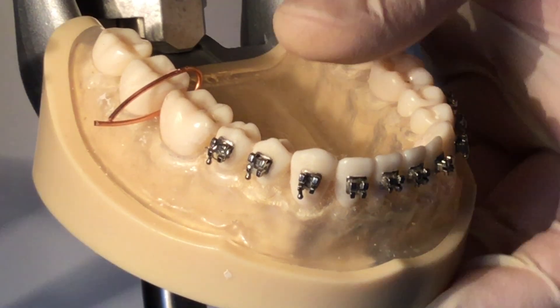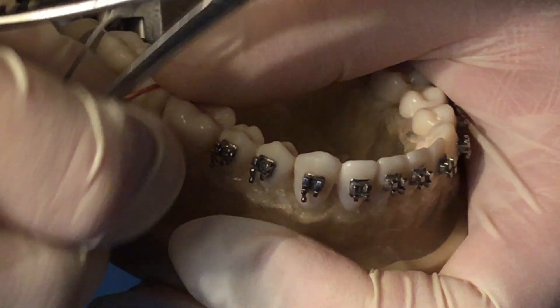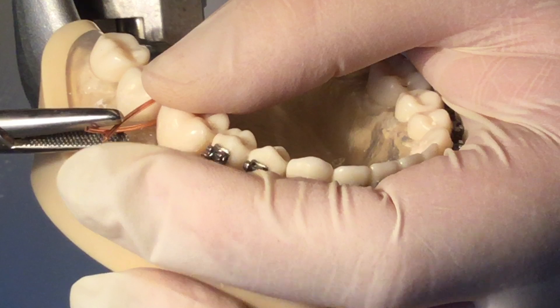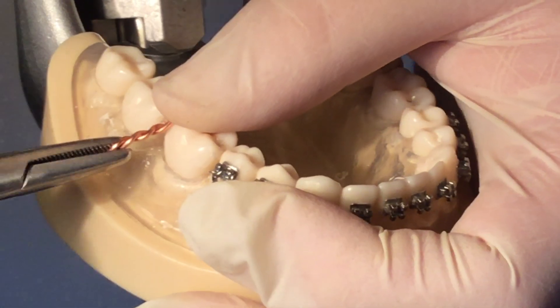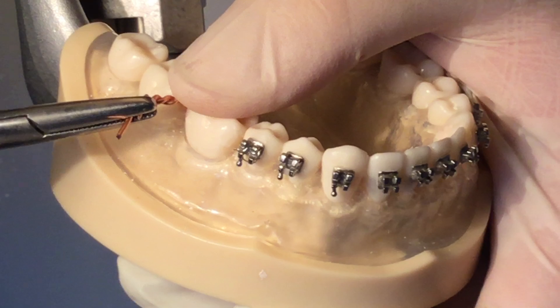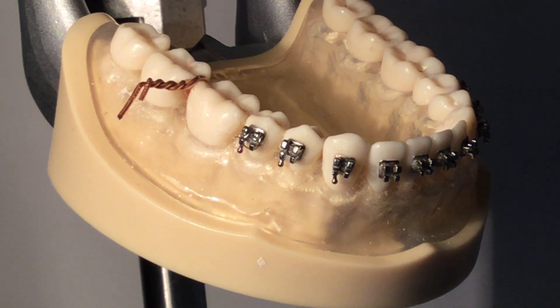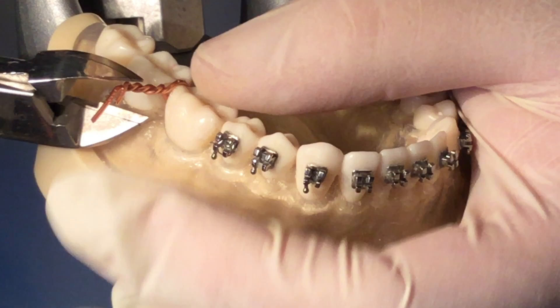With the hemostats, twist the wire in a clockwise direction. Using the wire cutters, cut a pigtail to about two to three millimeters long.